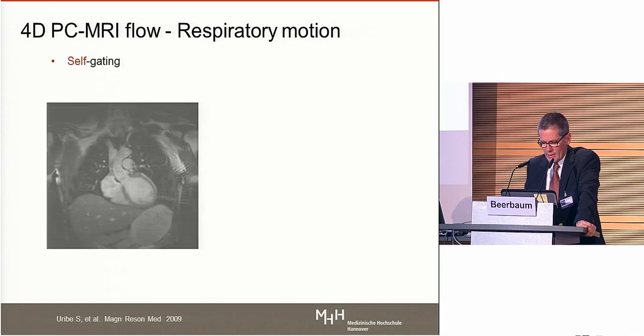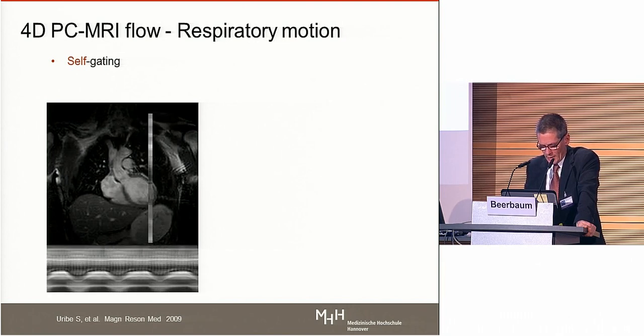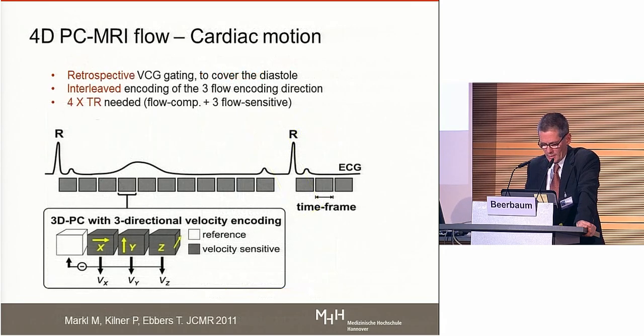These scans need a little bit of technical expertise. So basically you plan a box in the thorax around the heart, then you use some kind of control of the heart motion and of the respiratory motion. It's probably useful to do. Others use different approaches. Doesn't really matter as long as you take it into account.